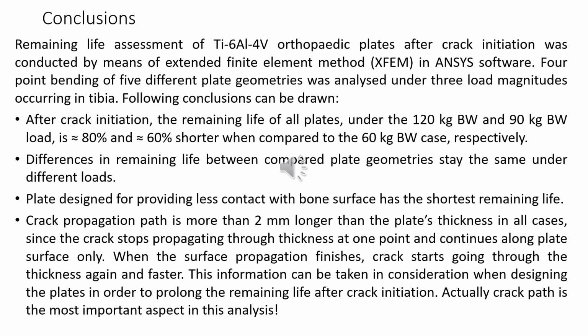Then we can conclude that differences in remaining life between compared plate geometries stay the same under different loading. And also we can notice that the plate designed to provide less contact with the bone surface has the shortest remaining life.